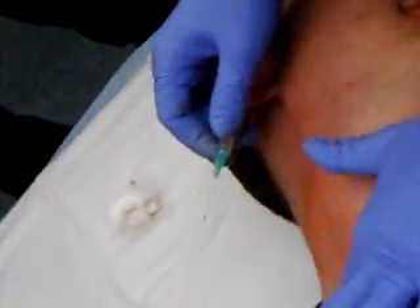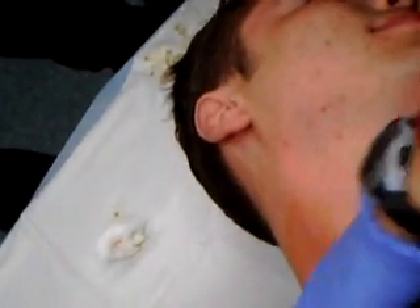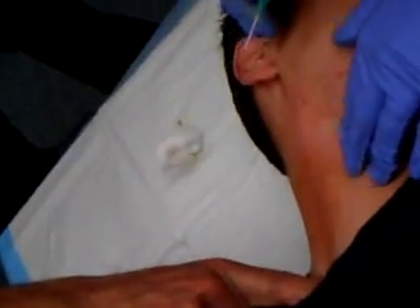When I hold traction, it kind of disappears, actually. Somebody put their finger right there — clean finger. Actually, you won't need to glove it because there's no blood — I'm not going to put any blood. It looks like a deadhead in my video camera. Deadhead? Yeah. Nice knowing you. See how it disappears.